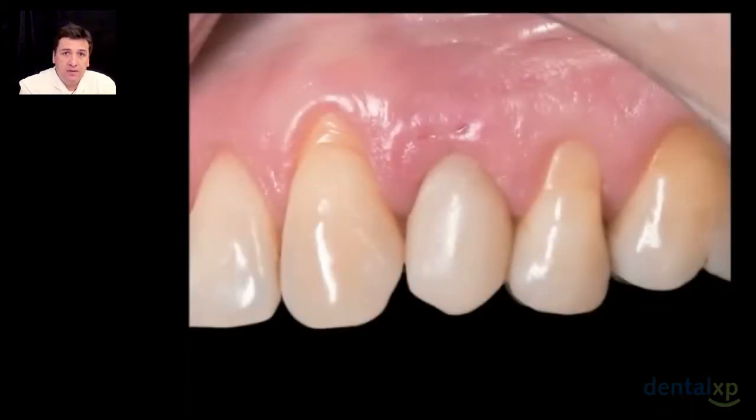After 1 week, this is the image that we will have, and we have to be very careful with this image because there is a little bit of inflammation, and we could feel very satisfied, but that will be retracted a little bit if you want. But we are on the correct way.